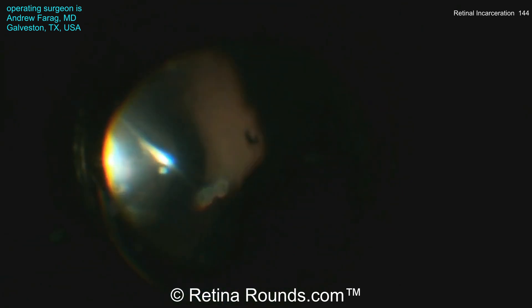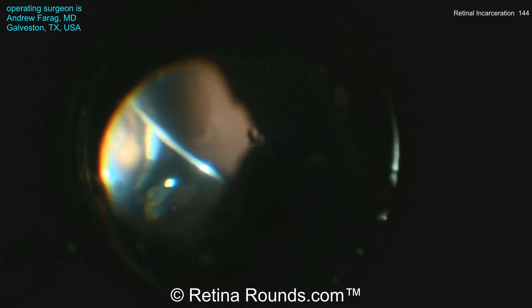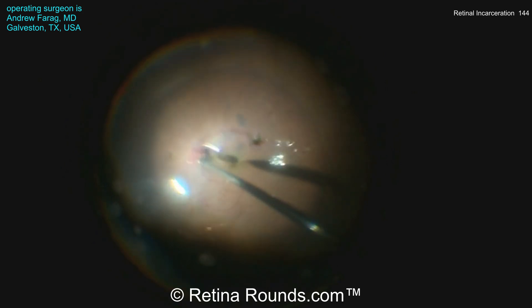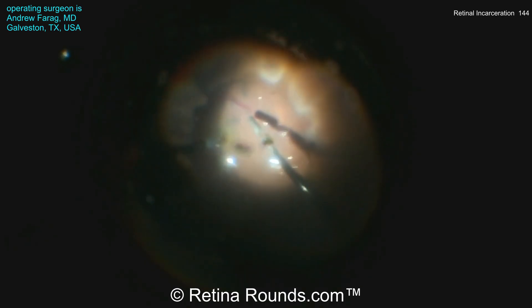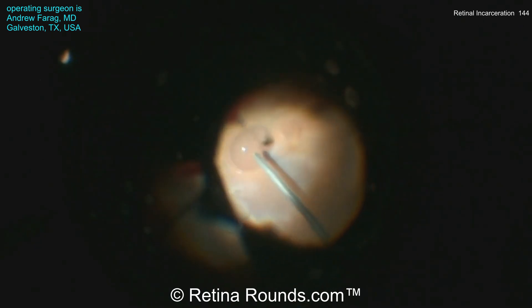Dr. Farag performs a limited retinectomy using the vitreous cutter to disengage the retina from the incarceration site. Prior to retinectomy, it is recommended to apply diathermy to decrease bleeding risk. Since the retina may be close to the RPE and choroid, using a lower vacuum level on the cutter helps avoid inadvertently engaging the choroid and causing a choroidal hemorrhage. The retinectomy is extended, but persistent fixed retinal folds are still preventing the retina from completely flattening.